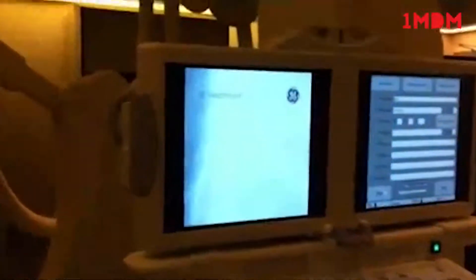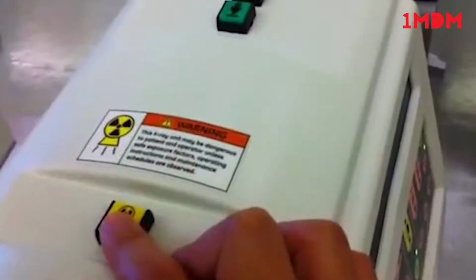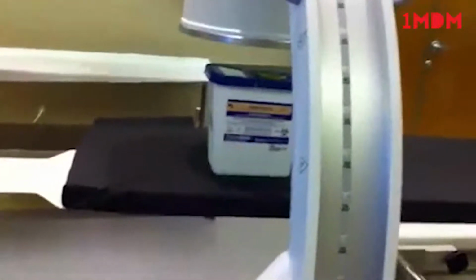And I will take a picture right now. Well, let's press exit here. All right, here we go. Okay, we're going to fluoro. There's two ways to fluoro here. You can just press it down really quickly and let go, and that'll just take a snapshot. If you press it down and hold it, that's continuous fluoro. Because we're just taking quick pictures, we're not going to fluoro. We're just going to take a quick snap here.